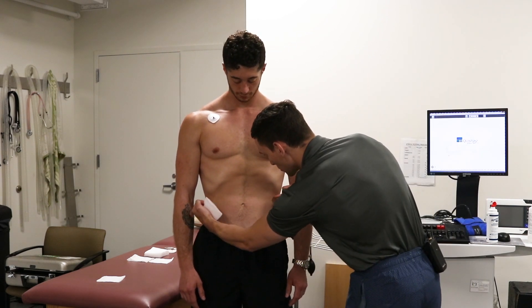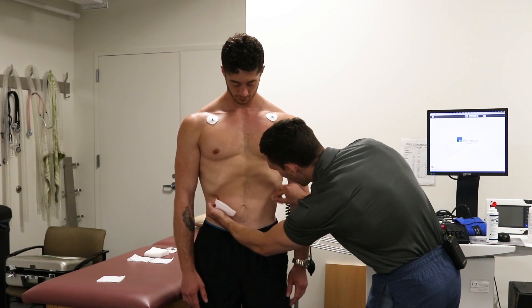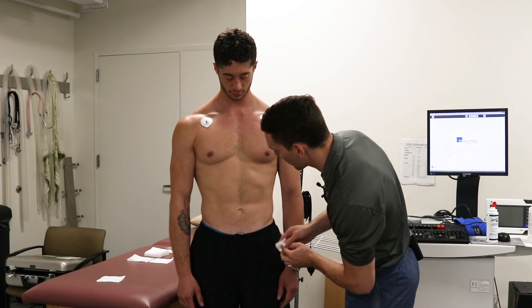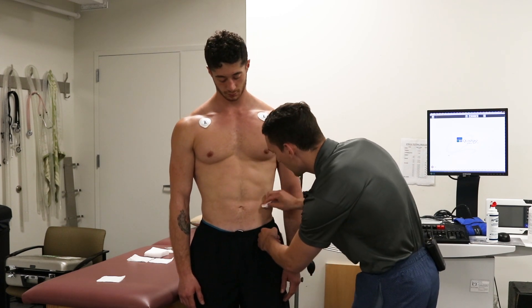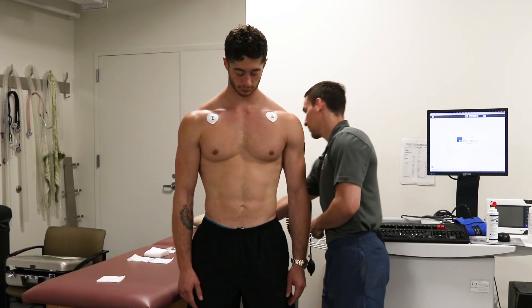We'll palpate those spots, looking for just the very bottoms of the ribs, going slightly below to make sure we're not over any bone. We're going to wipe with our alcohol first and then our clean gauze. Once again you can ask them to relax, look for those red spots from the abrasion, and place your electrodes.